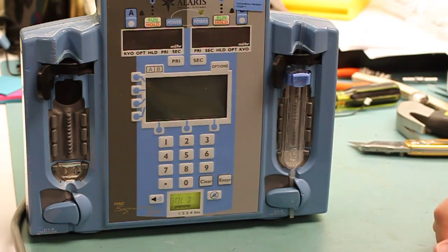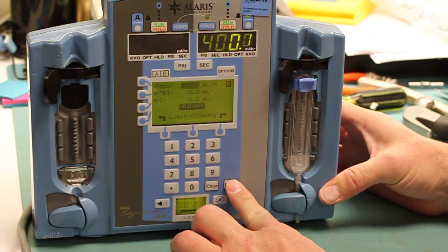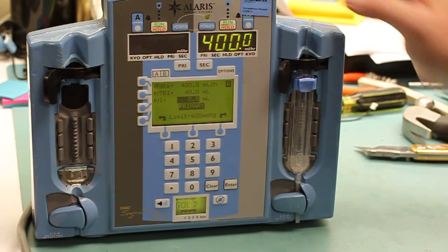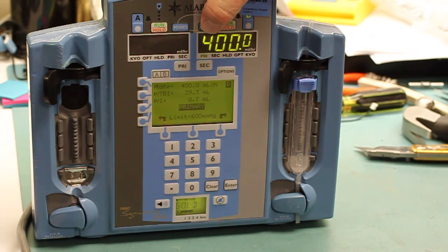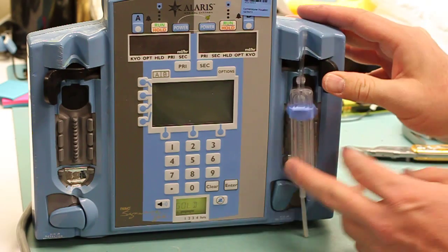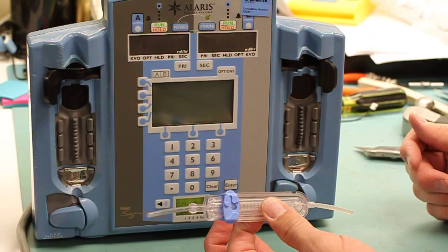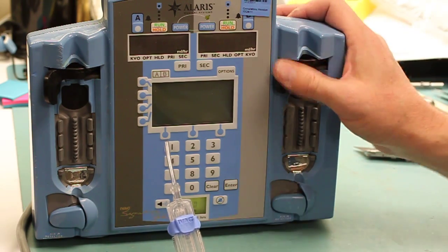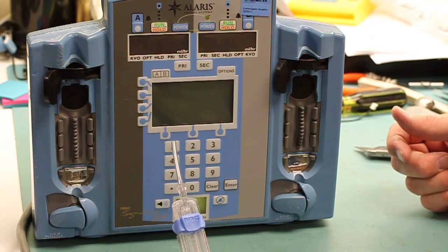Once we turn the unit on, we'll set an infusion and the unit will flow. Once the infusion is stopped and has run out, you would need to put it on hold, power down the unit, then open it up with the activation lever. The cassette will pop out — then return that back to the closed position so as not to damage anything further.